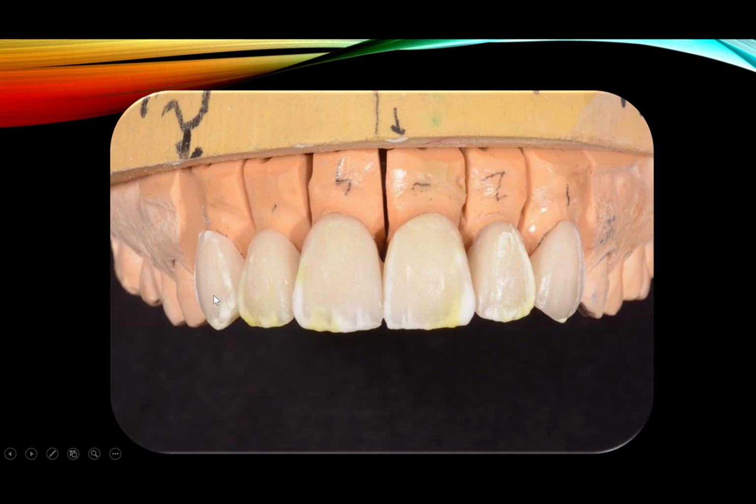This is how it's made. This is my monolayer. This is my micro layering. A little bit here, a little bit there, color coded. I only put porcelain where I need to put porcelain.